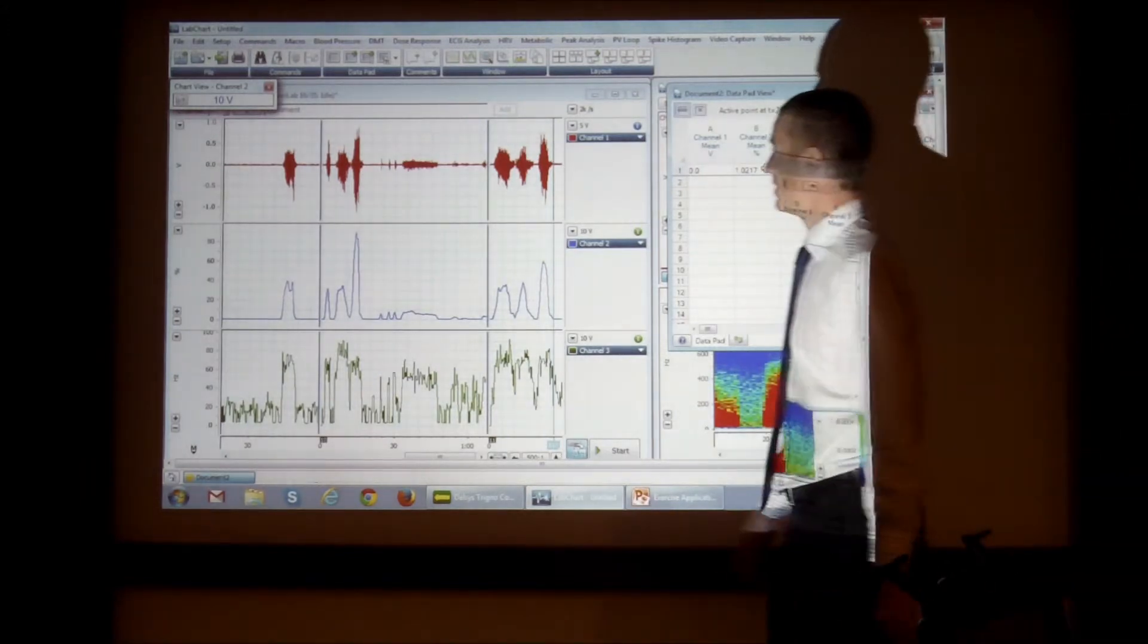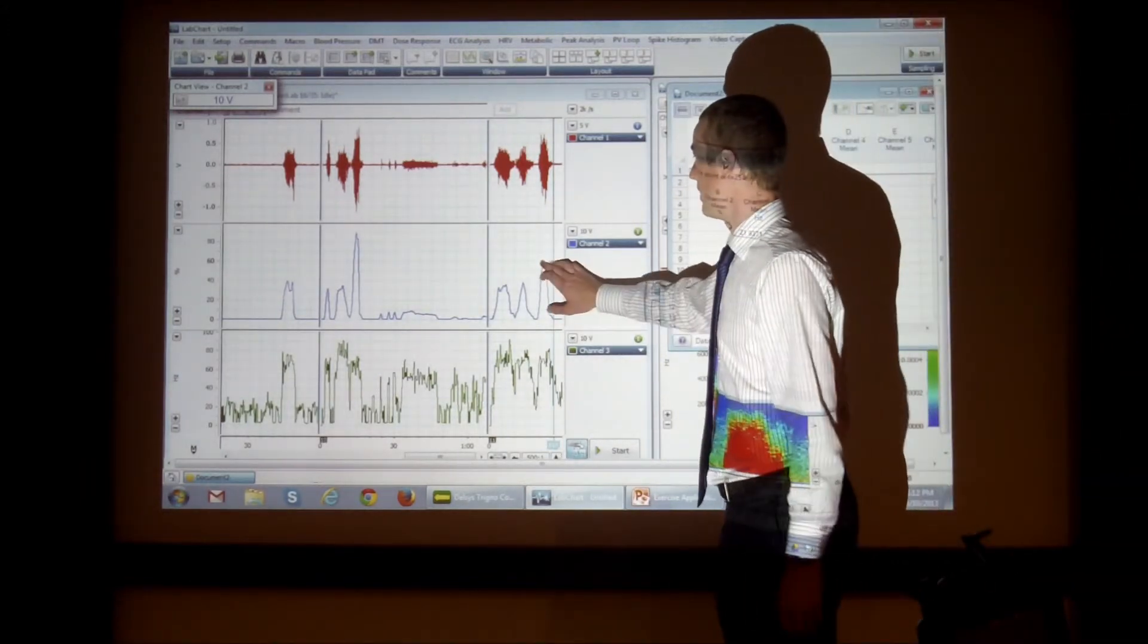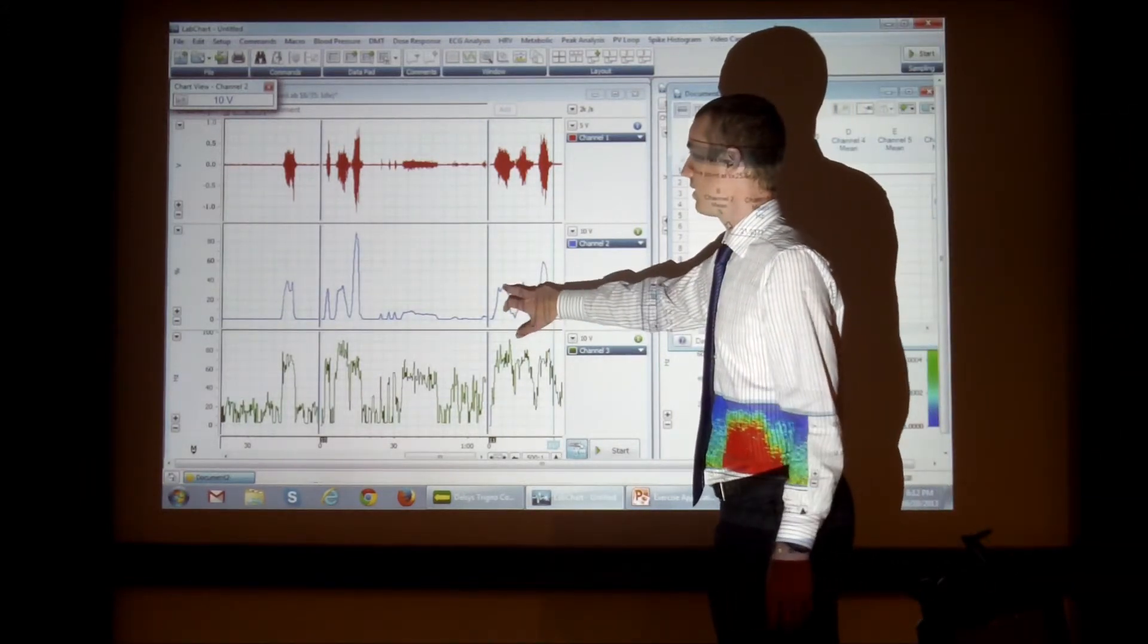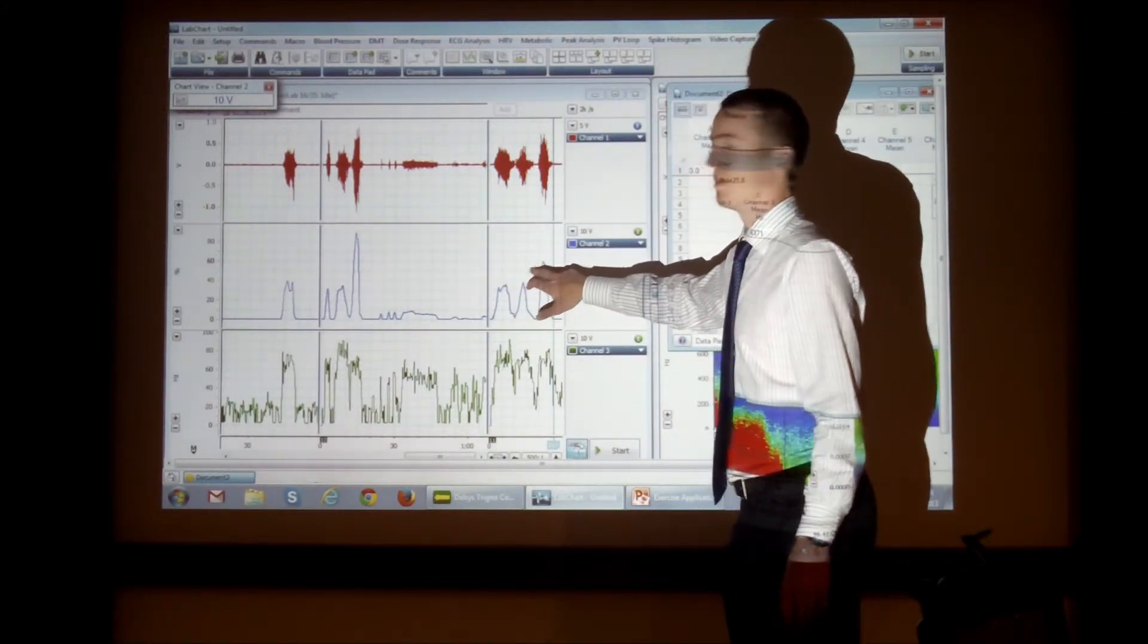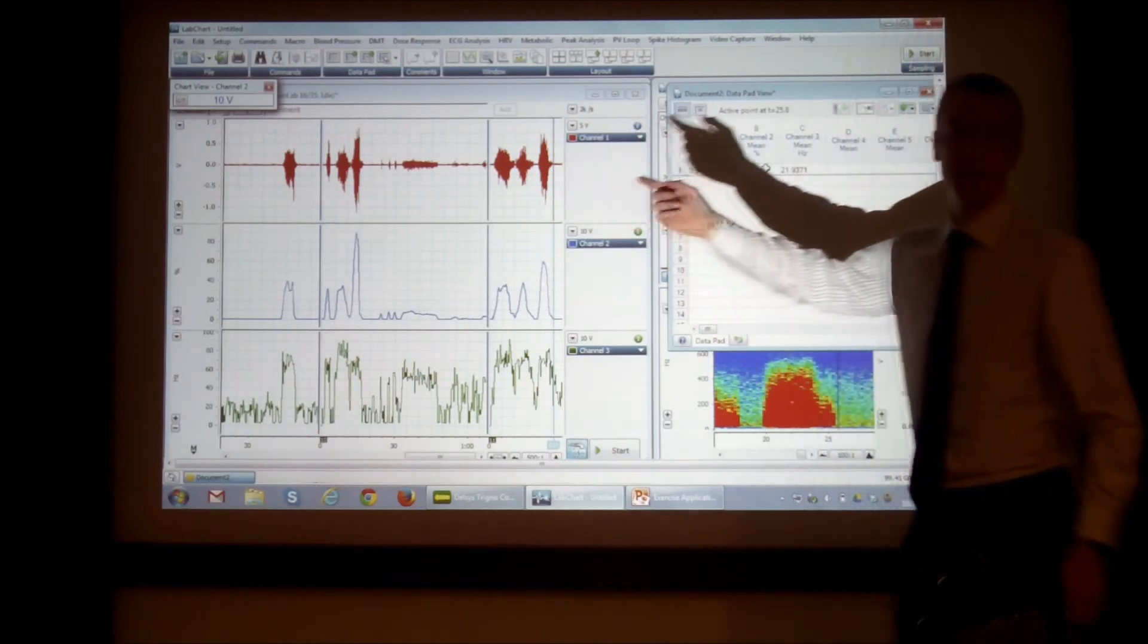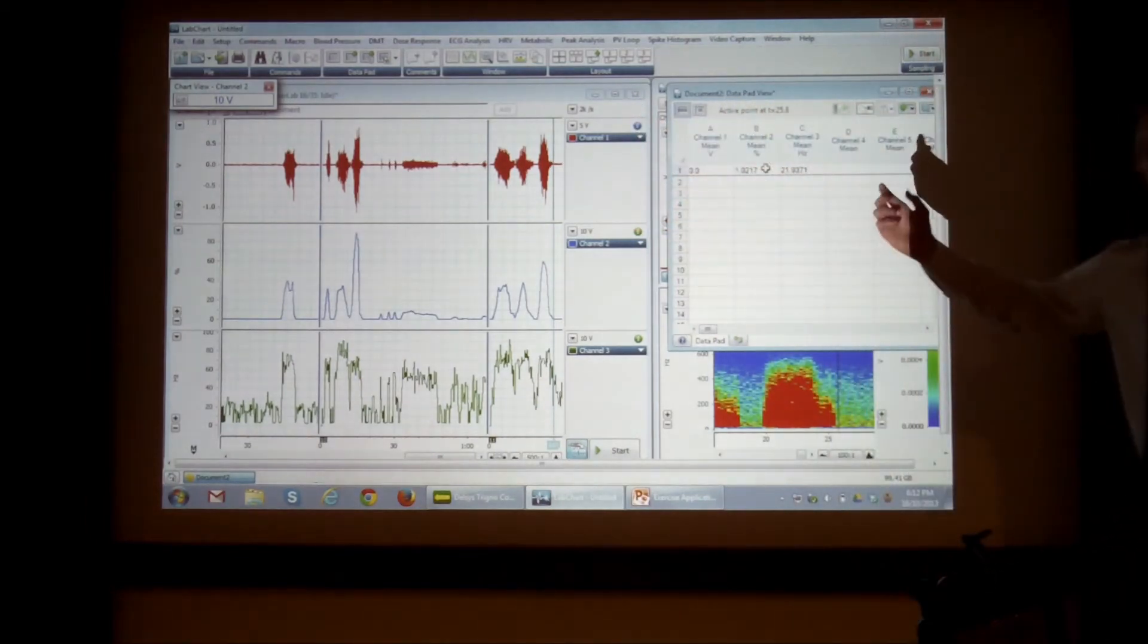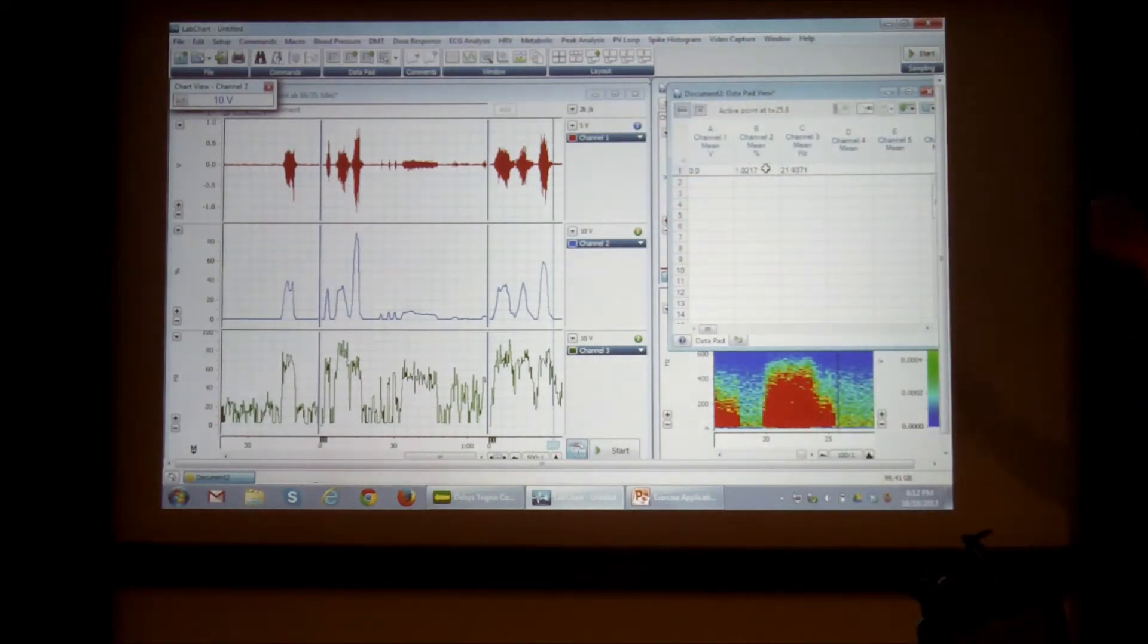So there's not much you can sort of extract from the EMG, but say if we want to, we can extract like our maximum RMS values for a particular set of muscle contractions.